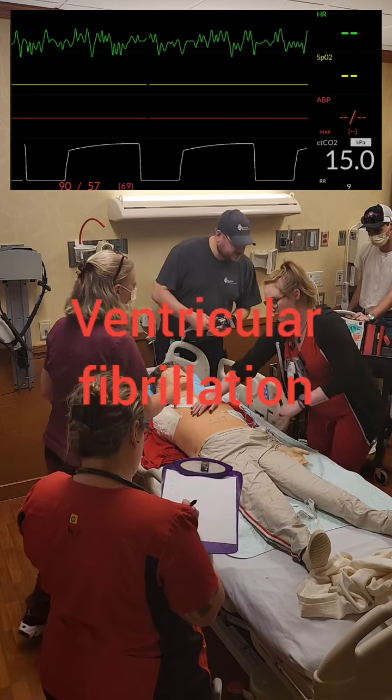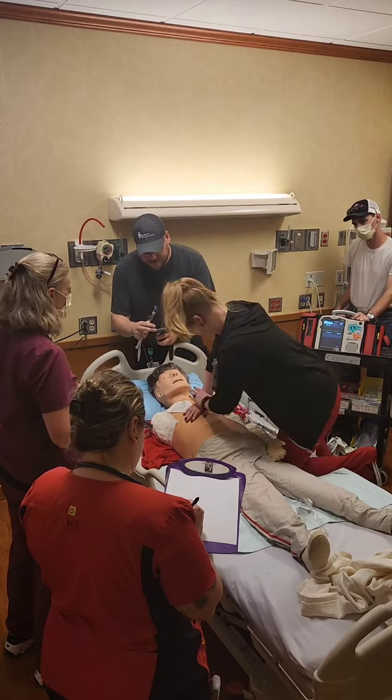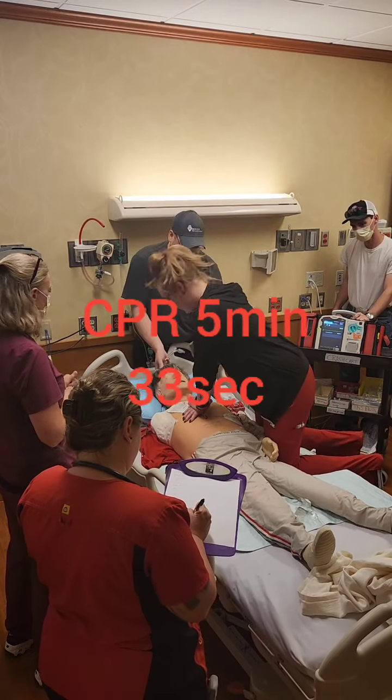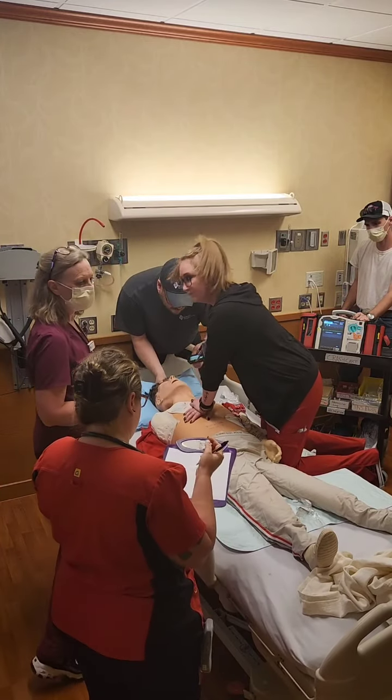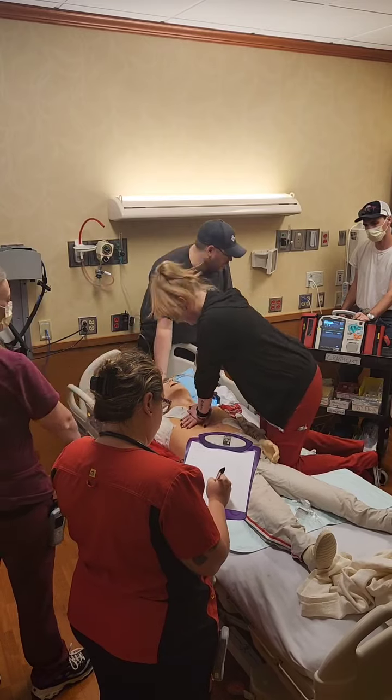Okay, start CPR. Hannah, you going to do CPR? Yep. Okay. Can we get the board behind you? Did we get the board behind you? No, we did not get the board because we didn't need it. Somebody grab the board? It's okay, we'll just imagine we have the board under there because we have the crash cart.